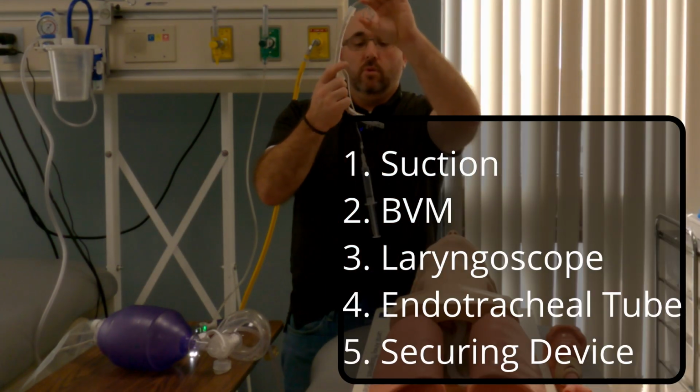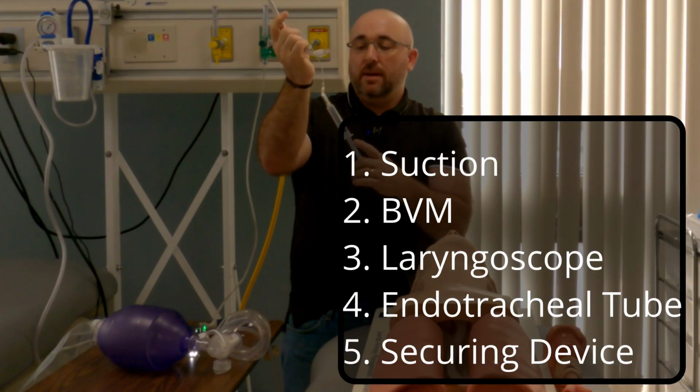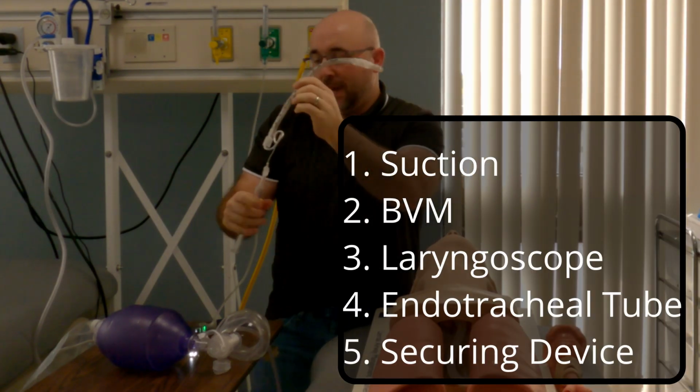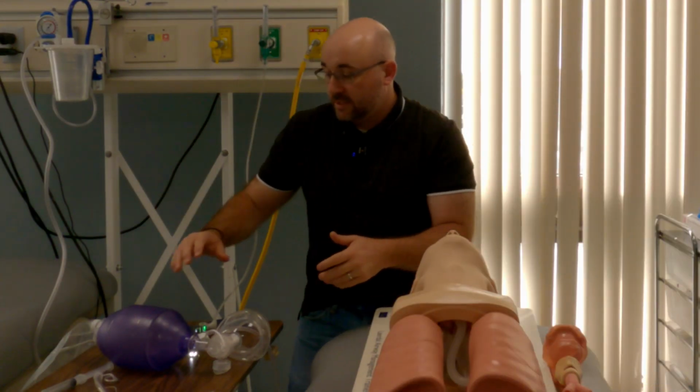Endotracheal tube with the cuff that's already been tested for integrity. Usually, in my case, I like to leave the syringe attached and the semi-rigid stylet inside. The bottom half is packaged. And the last thing that we have is the securing device. So let's go to ventilate this patient.